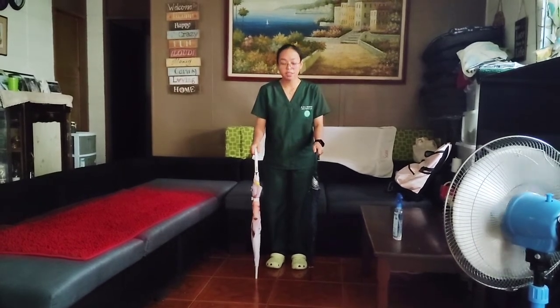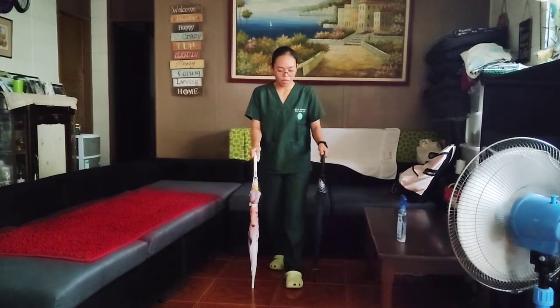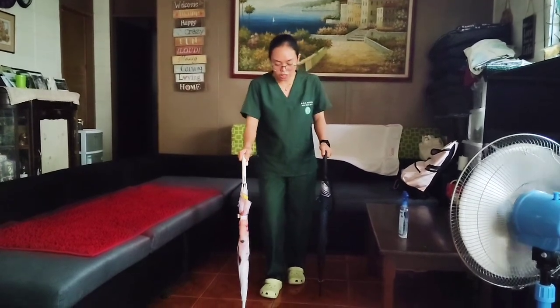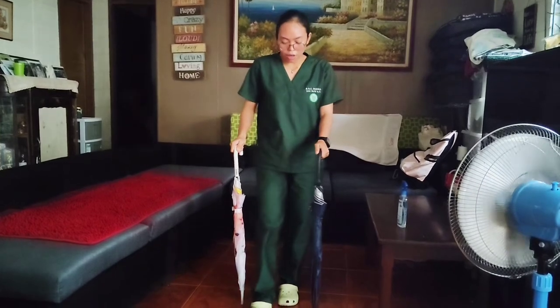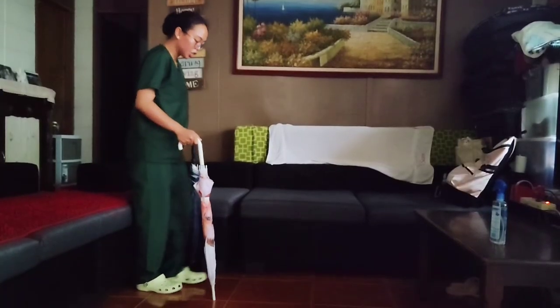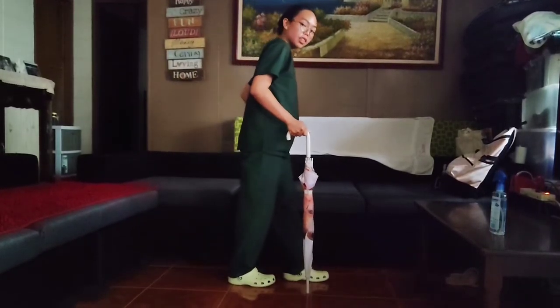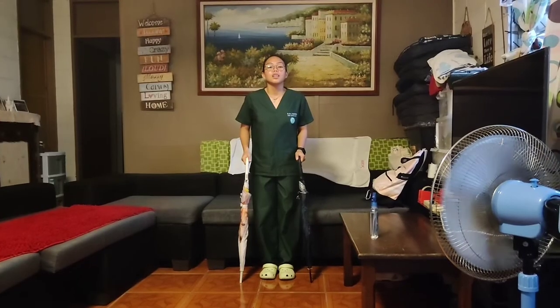For the 4-point gait demonstration: advance the right crutch, then follow with the left foot. Advance the left crutch, then follow with the right foot. This pattern alternates — right crutch with left foot, left crutch with right foot — repeated continuously throughout ambulation.